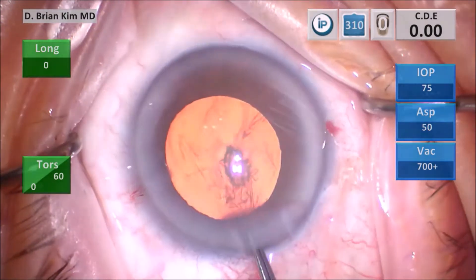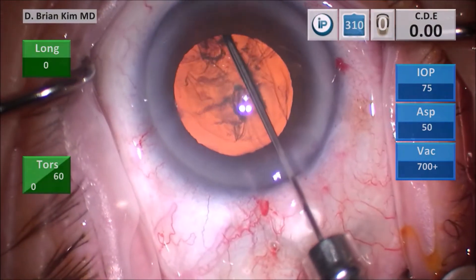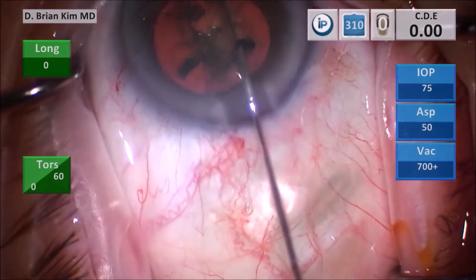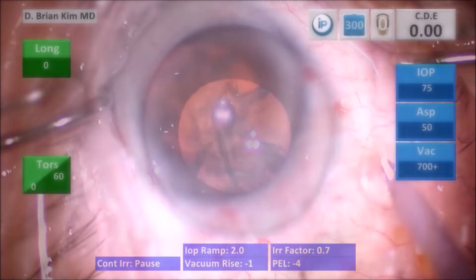I burp some viscoelastic out and then begin my capsular fornix hydrodissection technique. I place the cannula out to the contralateral equator underneath the anterior capsular surface, rotate the cannula tip 90 degrees downward, and get a nice fluid wave. I decompress on the left and then spin the lens to the right side.